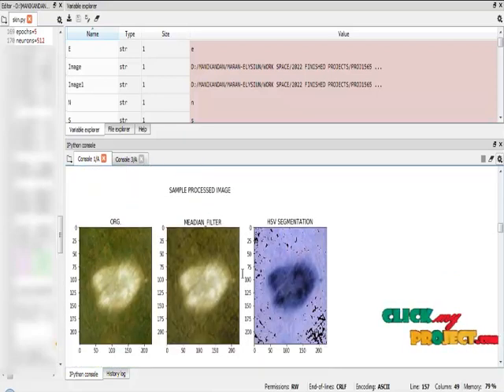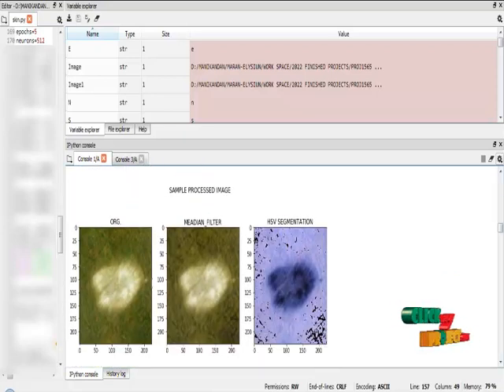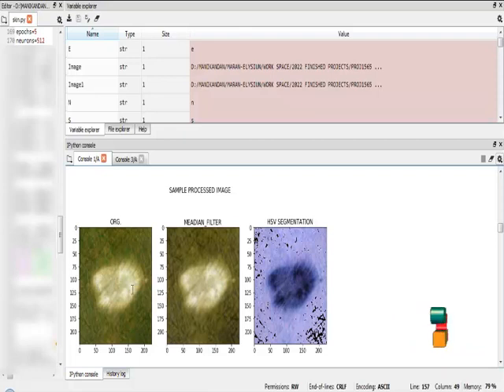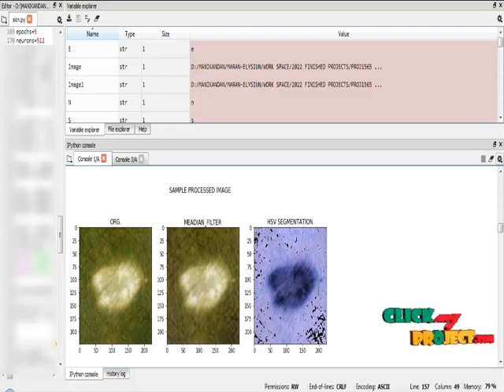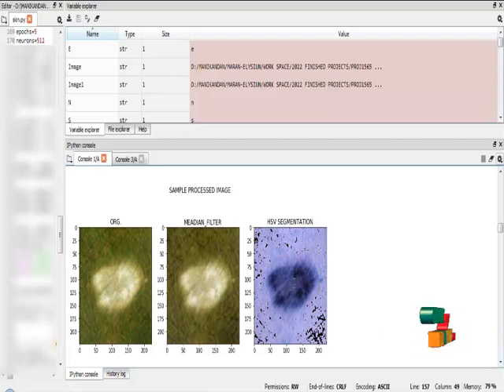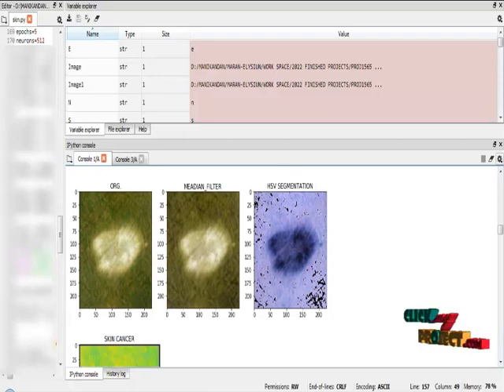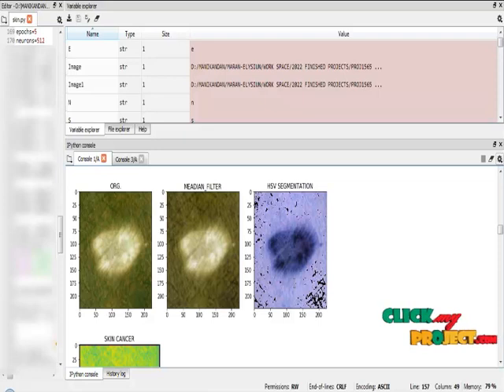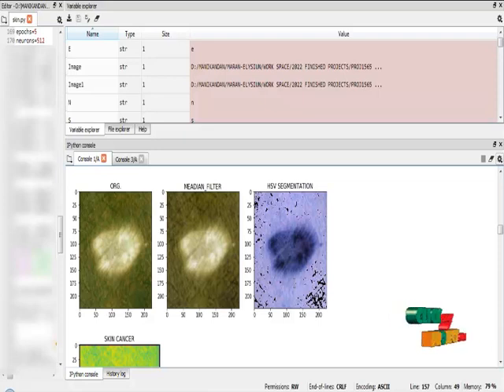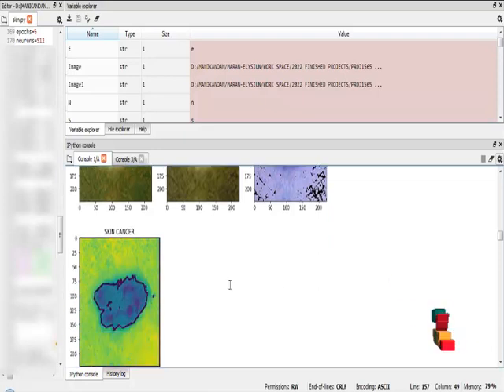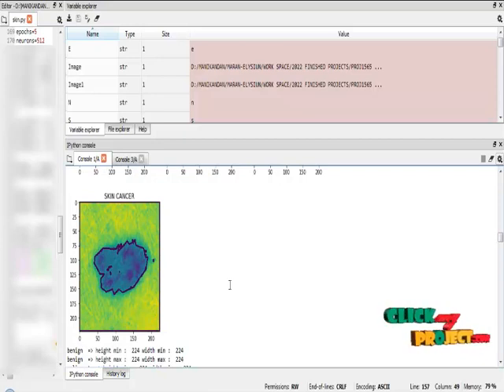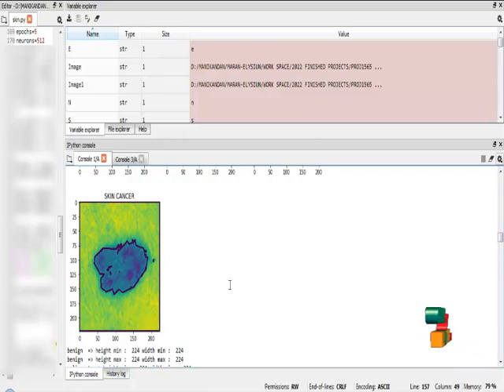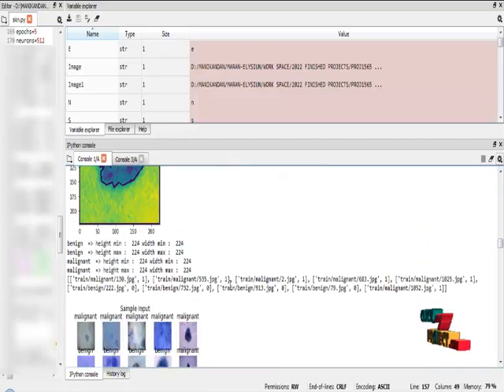And I am going to apply the YCbCr segmentation. In that, I am going to read the original images and apply the median filter, and apply HSV segmentation. HSV segmentation will predict the region of the cancer. After that, I am going to apply the HSV segmentation into contour detection.